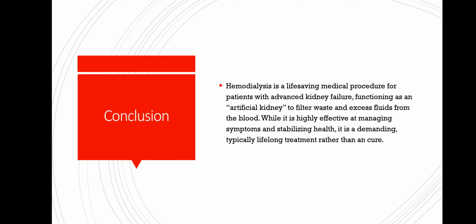The artificial kidney is also known as the dialyzer, which filters waste and excess fluid from the blood. While it is highly effective at managing symptoms and stabilizing health, it is a demanding, typically lifelong treatment rather than a cure.